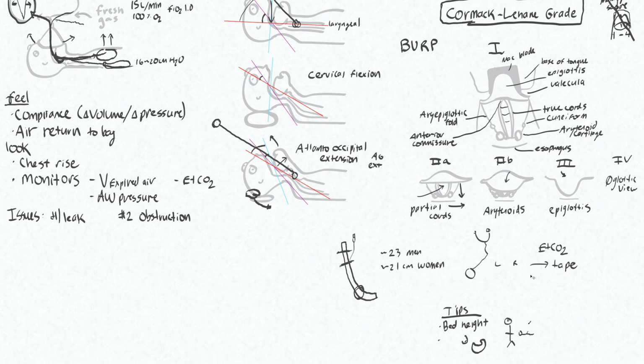because just like the diagrams I've shown, you get the best view actually from a distance here, and it looks a lot less awkward. That means that when you're intubating, or when you're doing direct laryngoscopy, your arm is pulling away from you, so you're kind of engaging your deltoids.